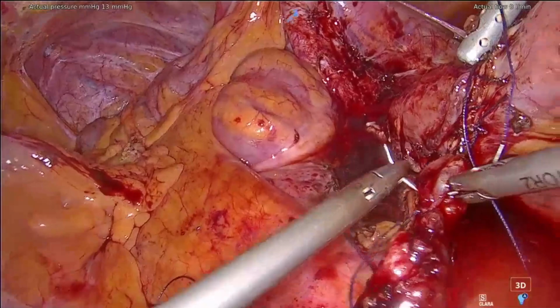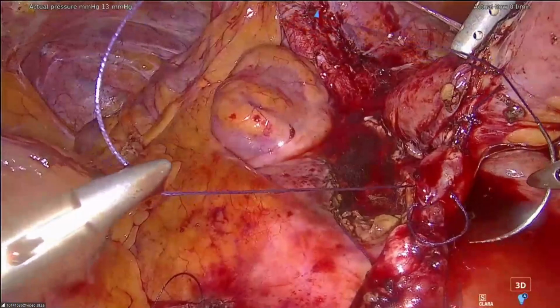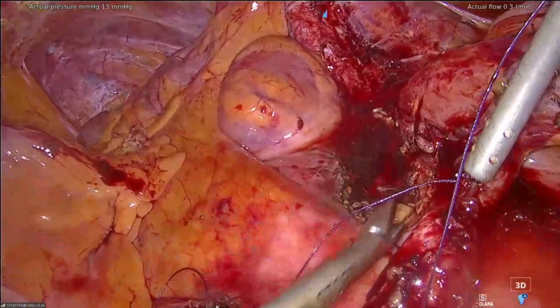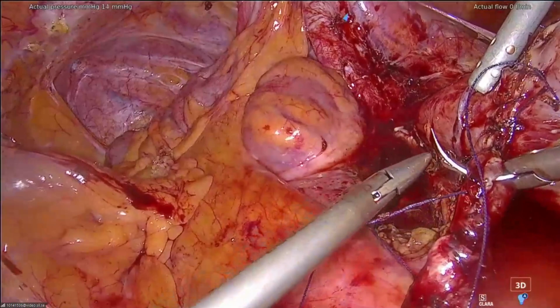I should have taken a little bit wider rectangle inside the bowel, because now I'm obliged to use really the edge of the tissue to secure the diameters of my tube. You see, if I took a little bit wider, I would have more length to create my tube, and it's more comfortable for me. Because now I need to do a really precise suture with just the minimum of tissue that I can take.